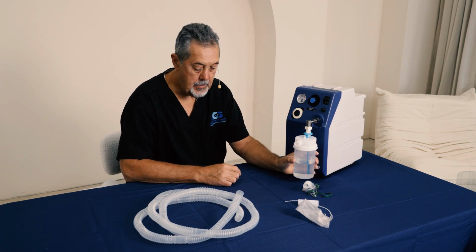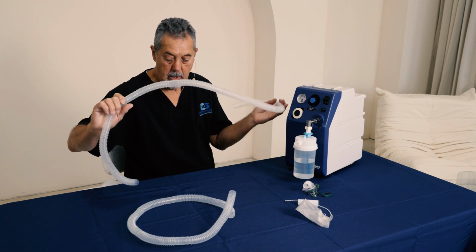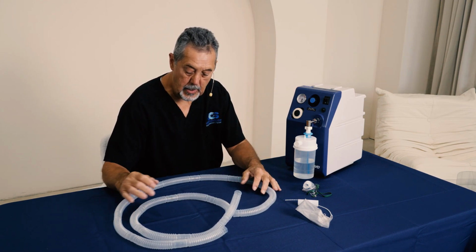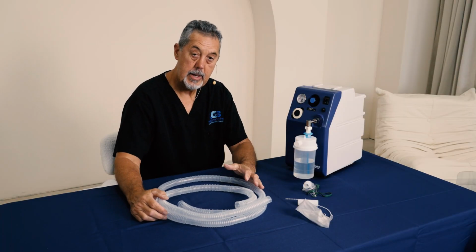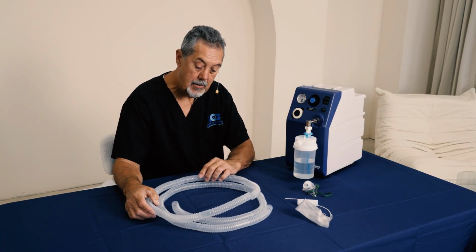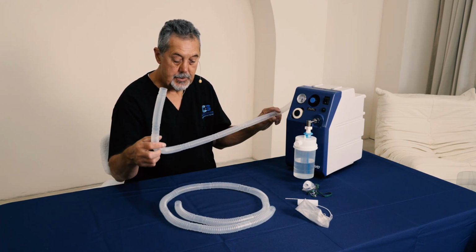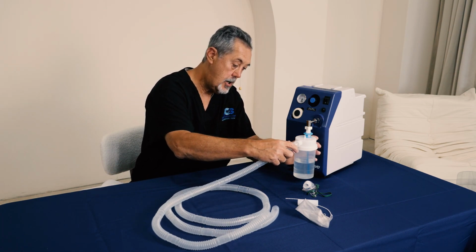On the other side of the large volume nebulizer, you're going to have your corrugated tubing. Now, the Durable Medical Equipment Company will provide you initially with 100 foot of this tubing. We recommend that every week you want to change out the tubing and replace it with new tubing. So you're going to cut the tubing in 2 pieces. 1 piece is going to go onto the large volume nebulizer.